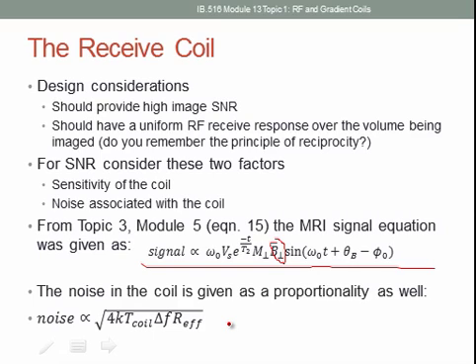That gets a little bit complicated when talking about the resistance of the sample, because we're not physically connected to the sample, but there is resistance because of dielectric and some other issues related to electromagnetism. But take it on faith that the electronics in our system are adding only a small bit of resistance relative to the amount of resistance generated by the sample.